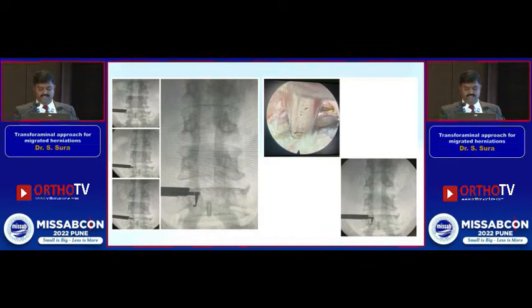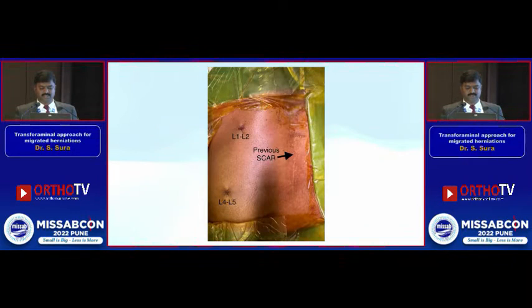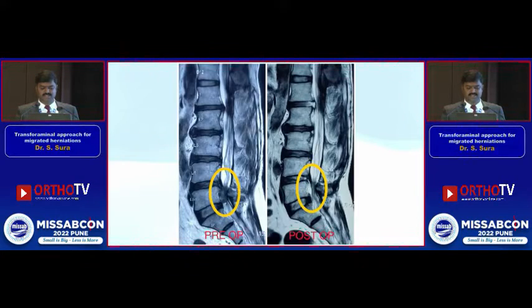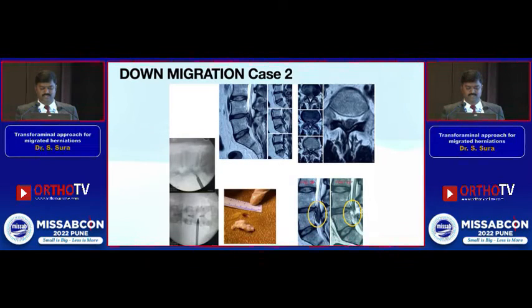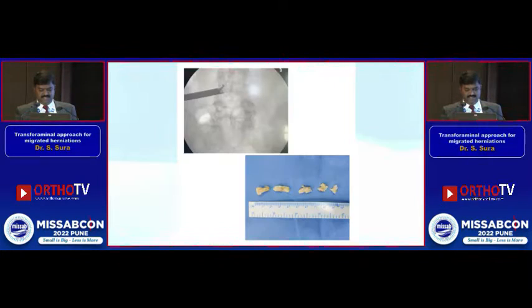So it's one more case where I just want to show you the fragment which is there. This is a post-op. It's a previous scar, there was a previous laminectomy done in this patient. So this is one more patient, it's a post-op. So one more case, again inferiorly migrated. So it's an up migrated case one.